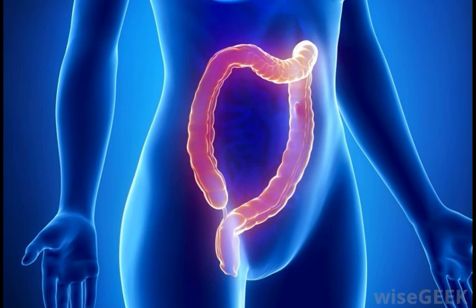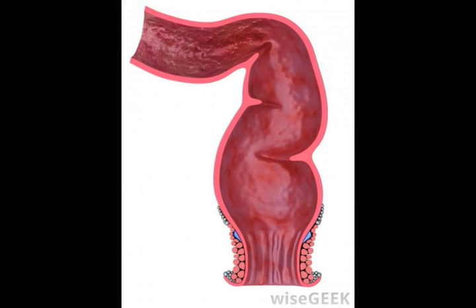In some cases, a rectal tube refers to a balloon catheter, which is commonly used to help reduce soiling due to chronic diarrhea. This is a plastic tube inserted into the rectum, which is connected at the other end to a bag used to collect stools. It is only to be used when necessary, as the safety of routine usage has not been established. Serious complications have also been noted, and include rectal perforation and reduced sphincter muscle tone.